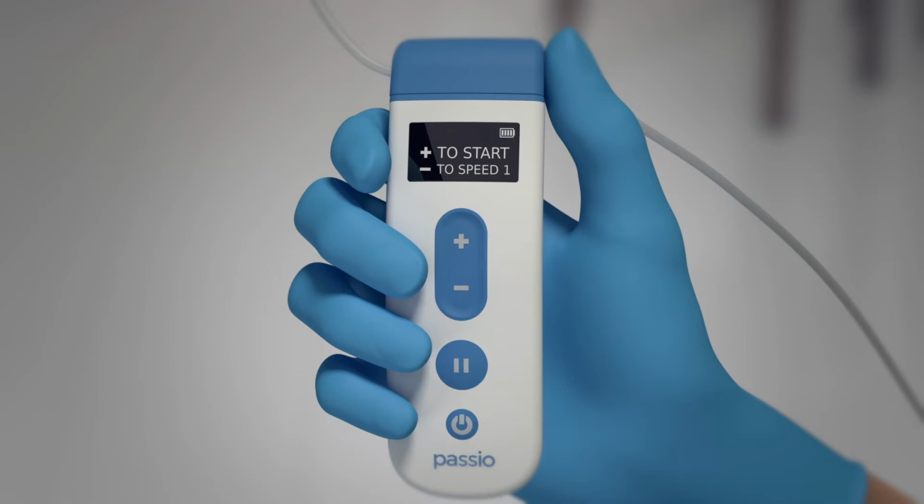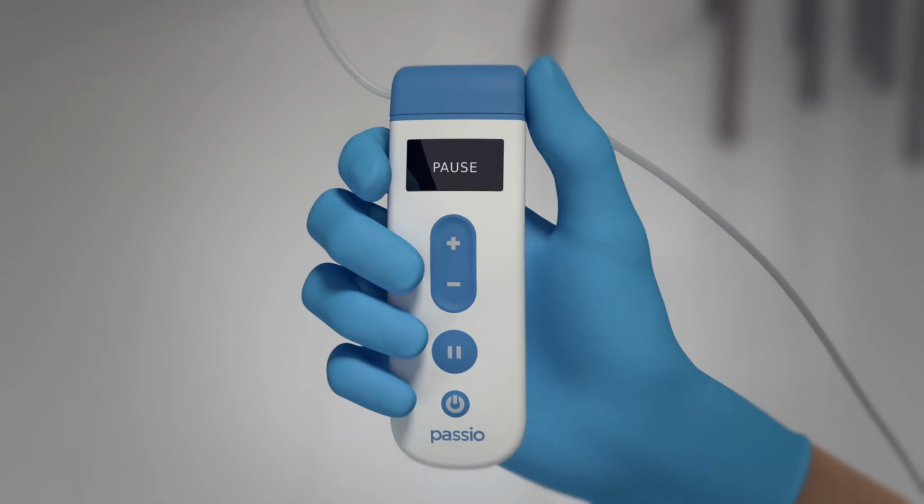To initiate the priming process and begin the flow of fluid, press the plus button once. The handheld control unit will automatically prime the tubing with fluid and then automatically shift to speed 1. Continue to increase the fluid flow rate by pressing the plus button to go up to speed 4, as long as the patient is still comfortable. In order to slow the fluid flow rate, press the minus button. Once the collection bag is full or the fluid flow has stopped, press the pause button to end the therapy.